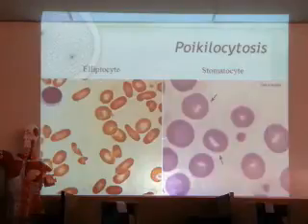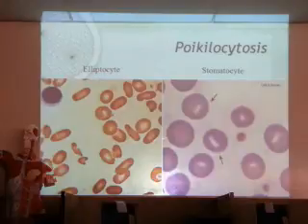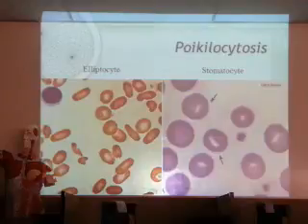Now we're concentrating on normal human adult red cell morphology here. If you look at cells from other animals, they're not always like human. For example, camel blood is normally elliptocytic. So here we're only talking about humans.